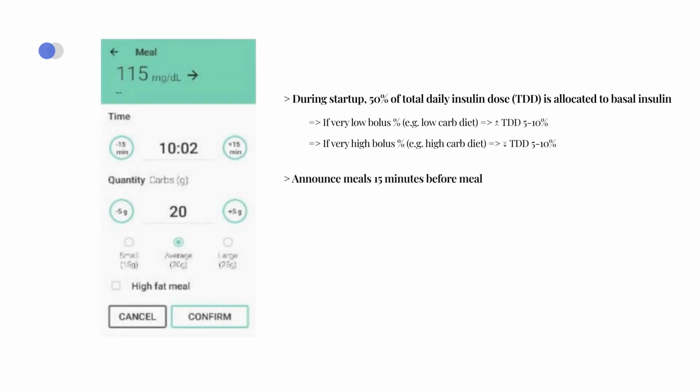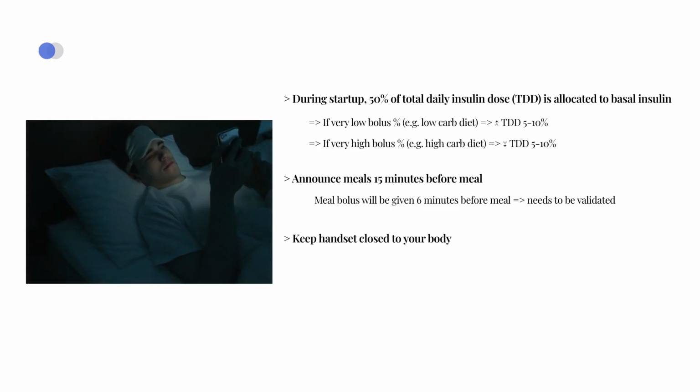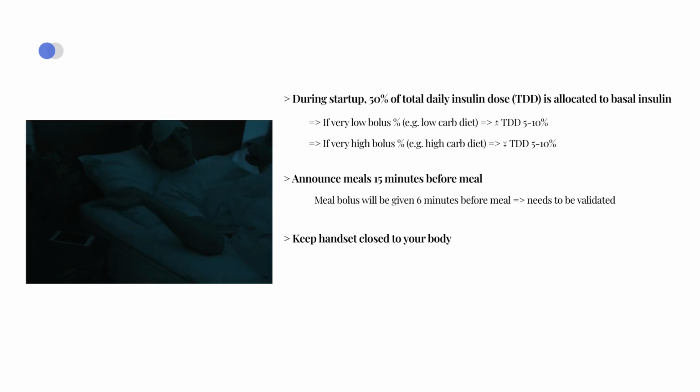It's advised to enter your meals at least 15 minutes before the meal, although the actual insulin bolus will only be given 6 minutes before the meal. Don't forget to validate the insulin bolus at that time, or the insulin will not be given. Keep the handset close to your body or within arm's reach and charge it overnight.